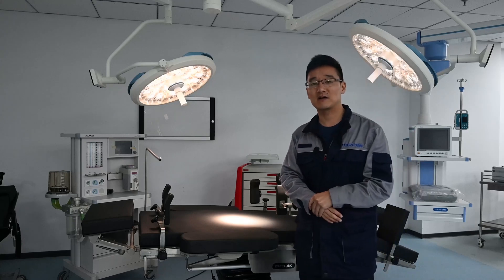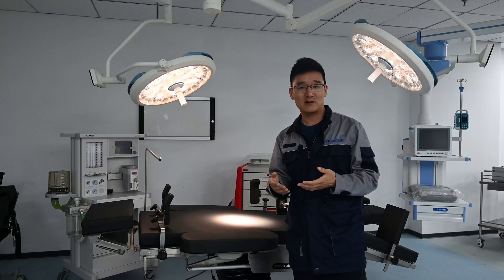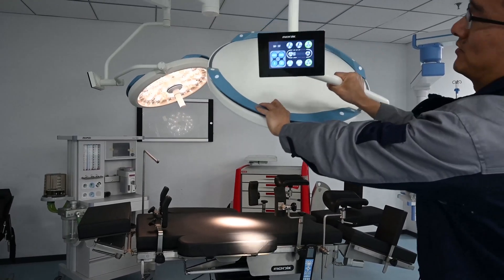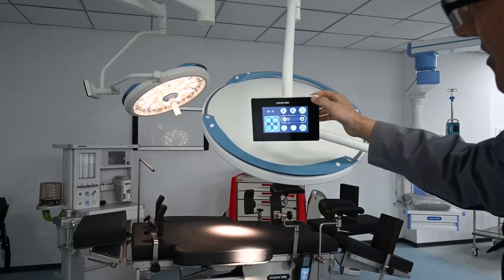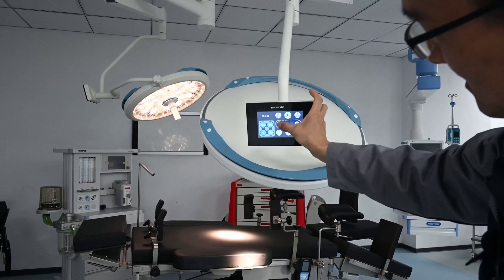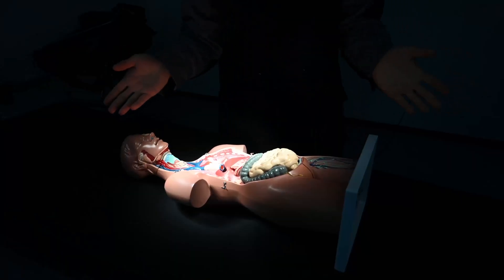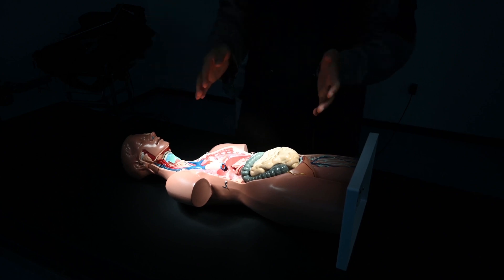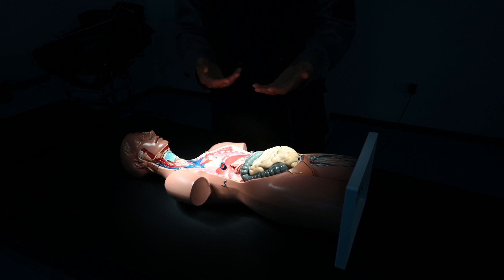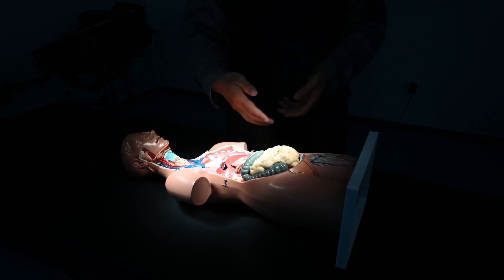However, it doesn't mean higher color temperature is always better, because surgeries take time and high color temperature light can cause eye fatigue. Color temperature can be adjusted from the touchscreen. We adjust it down to around 3000 K and can see the light becomes a little yellow and warm. In this condition, doctors will not get fatigued easily, but the color difference between different organs and veins cannot be reflected very clearly.